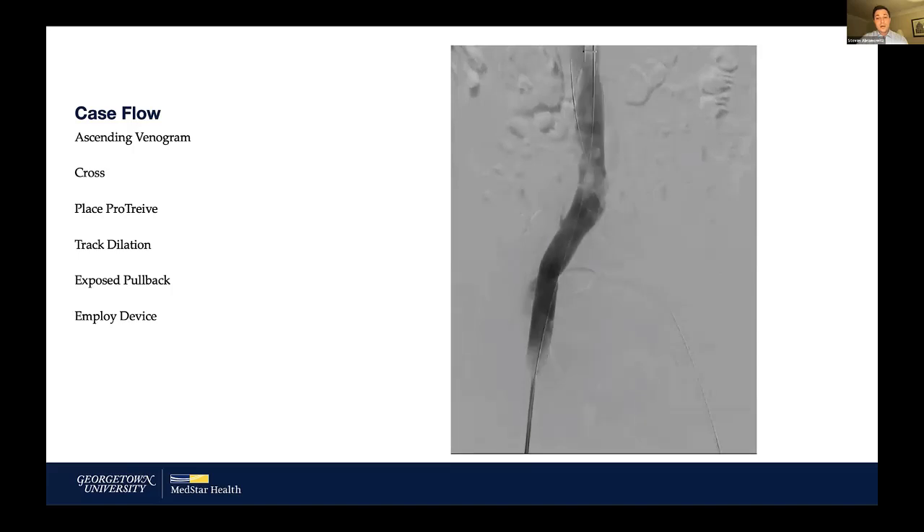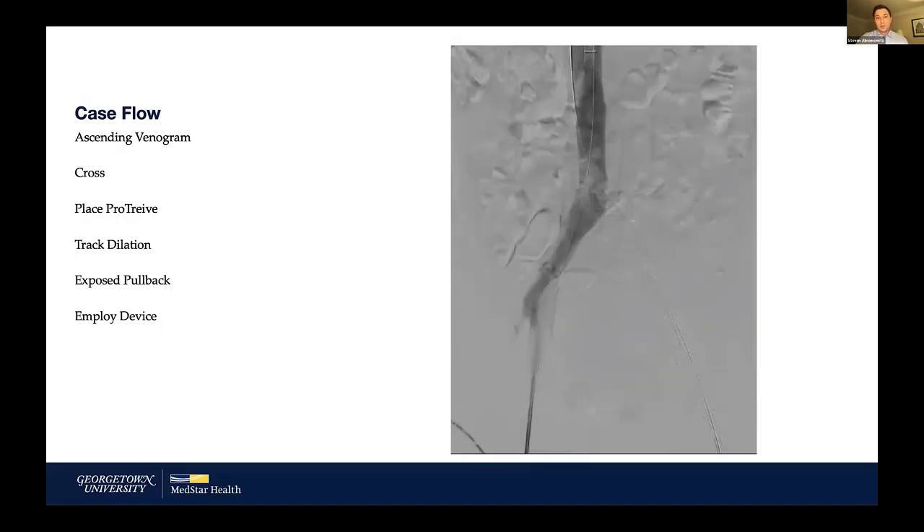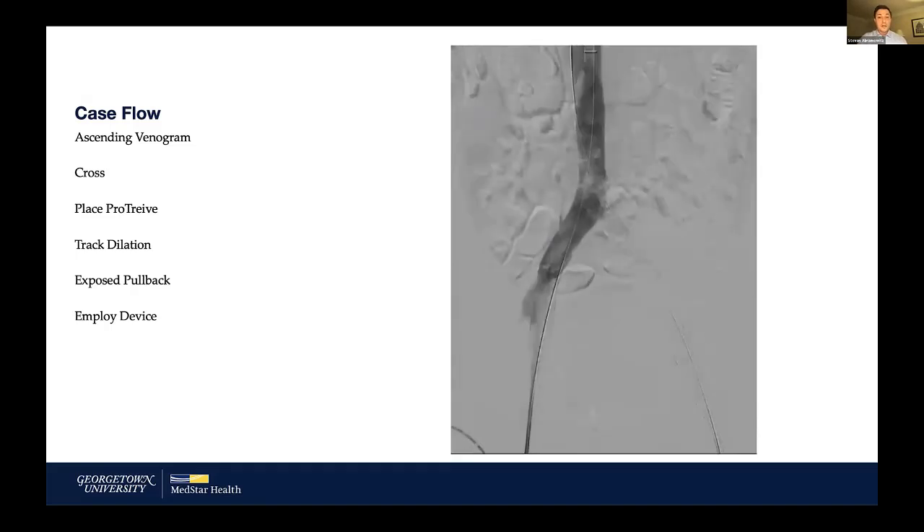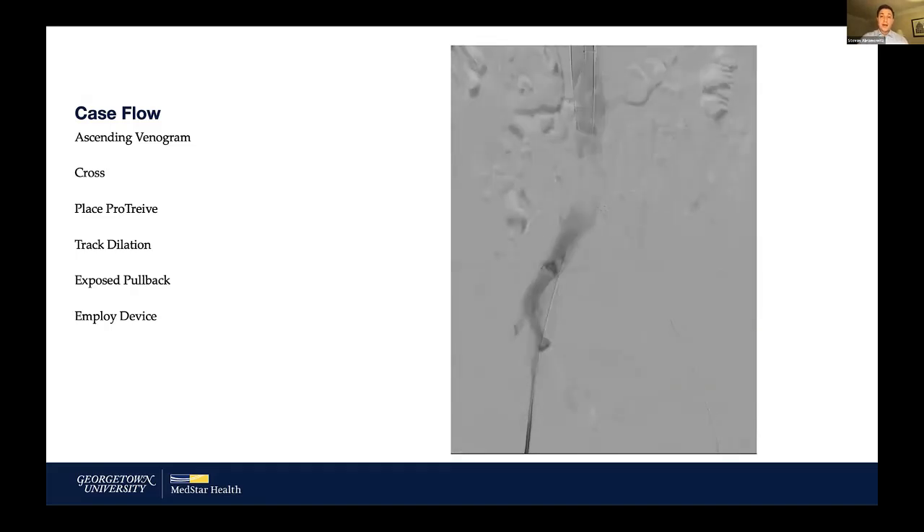Continuing to work generated more material, so I would remind you to continue to aspirate. I learned quickly that continual aspiration from the Protrieve sheath was very beneficial. I should mention I performed this on full dose anticoagulation — the patient was on Xarelto and did not stop the medication for the procedure. I was continually aspirating material through the Protrieve sheath to prevent lining of the Protrieve and stasis in the IVC.